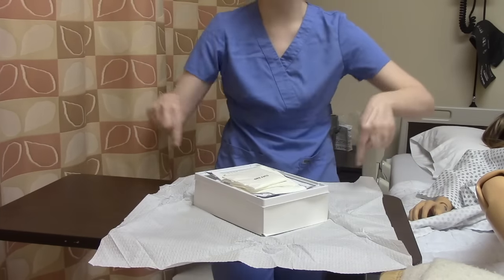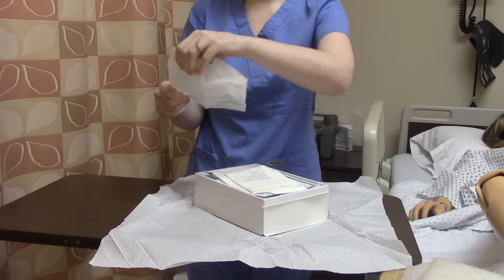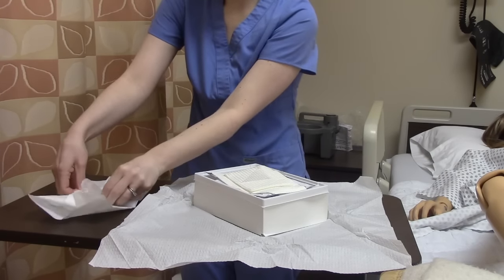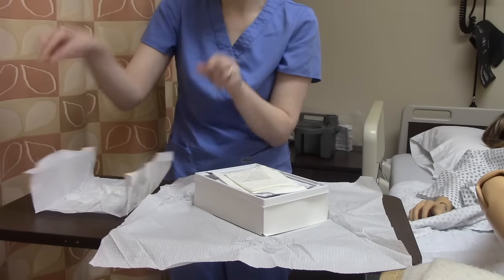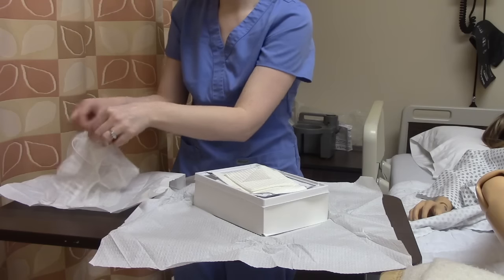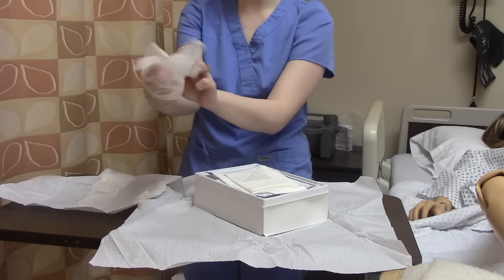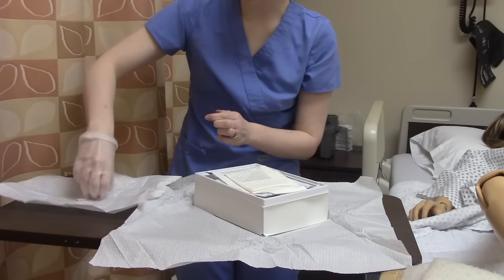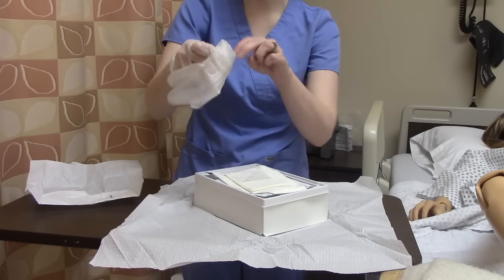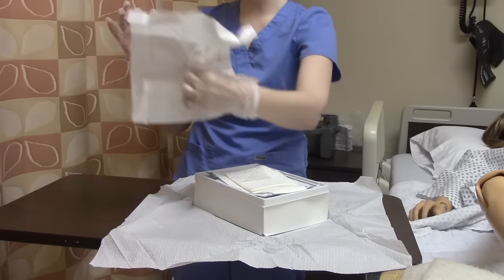So I'm going to put on my gloves. Bear with me here — the gloves like to crinkle and fold back up on you. You only want to touch this part of the glove because this is going to be the inside that touches your hand. Now we're going to put on our second glove and sneak our sterile gloved hand onto that little cuff of the other glove to put it on correctly without touching anything. Now we have our sterile gloves on.